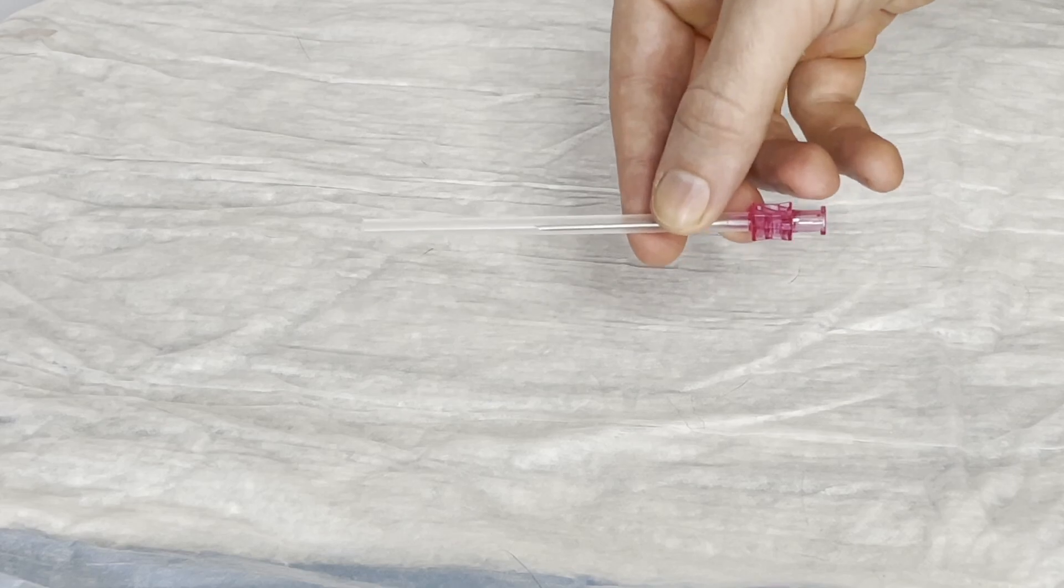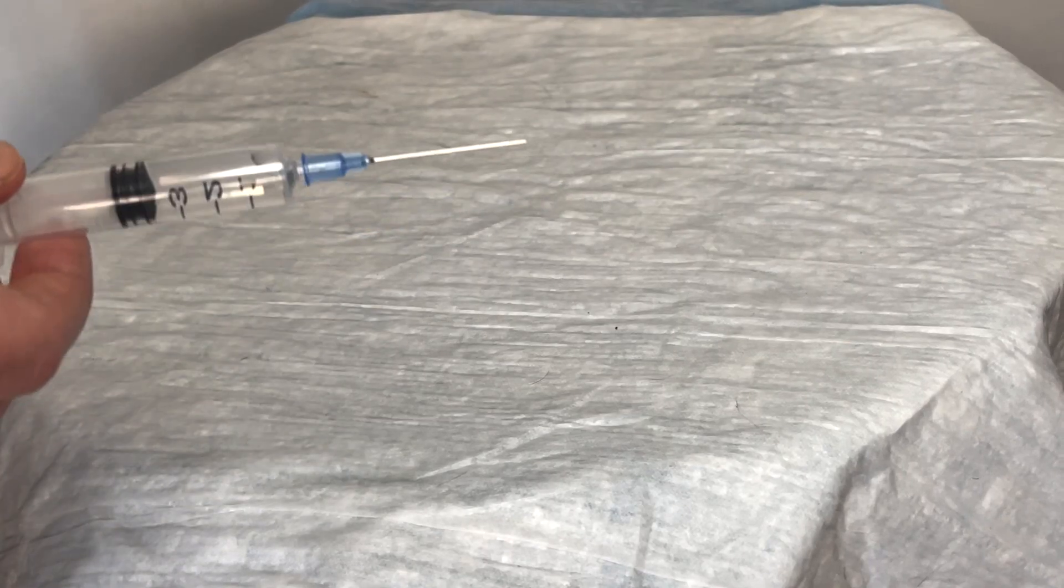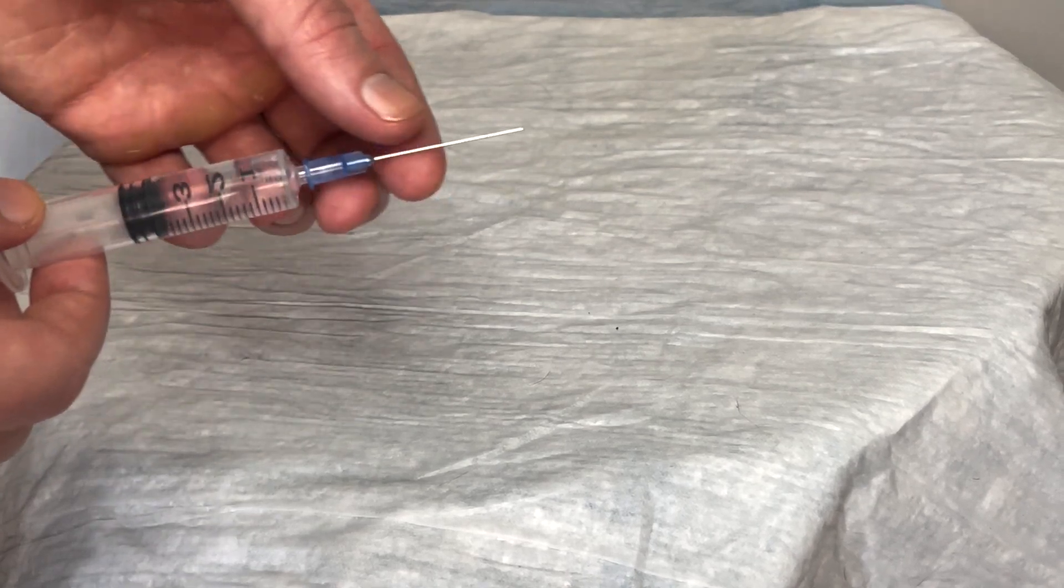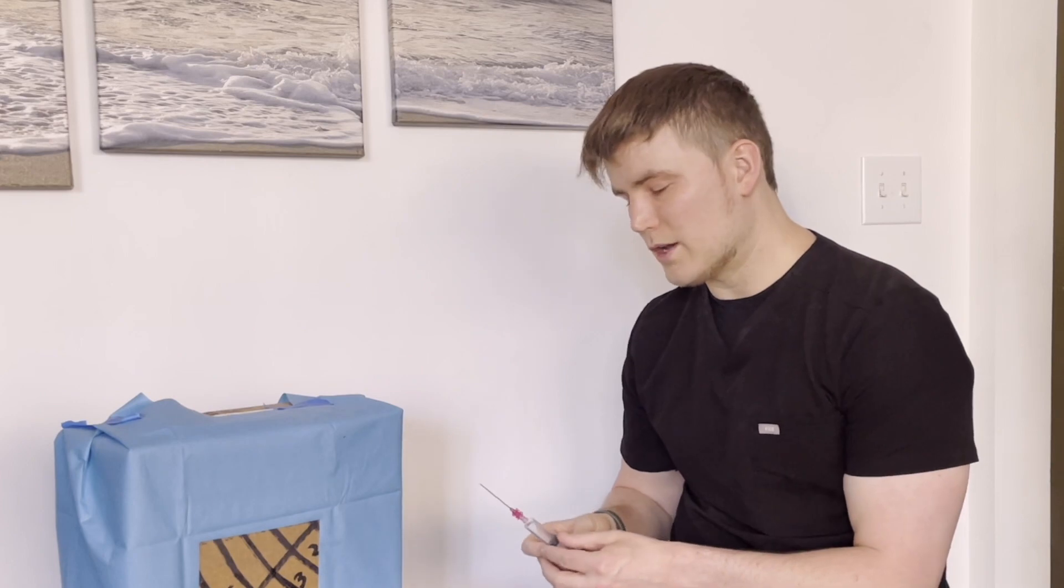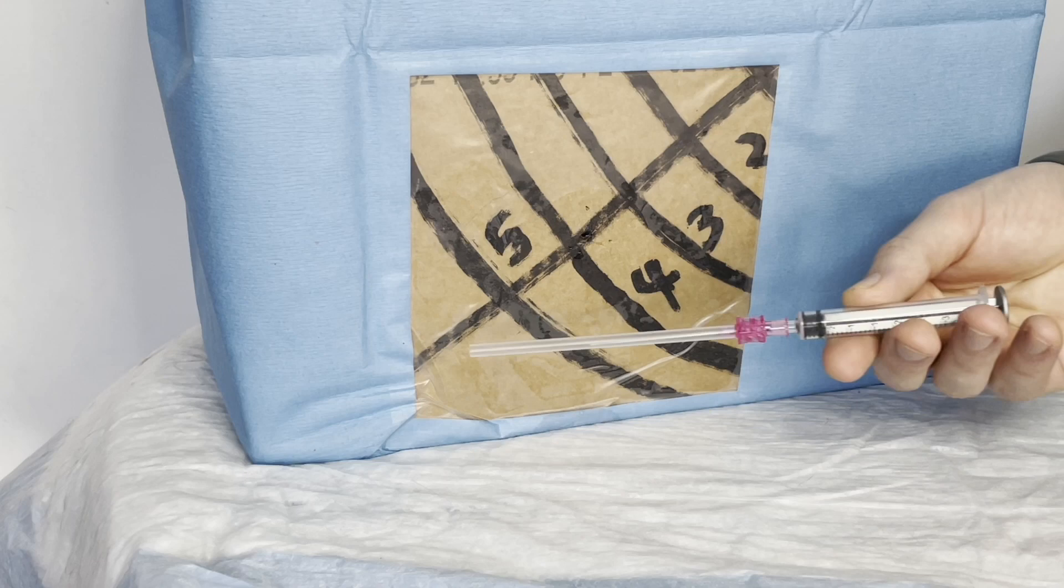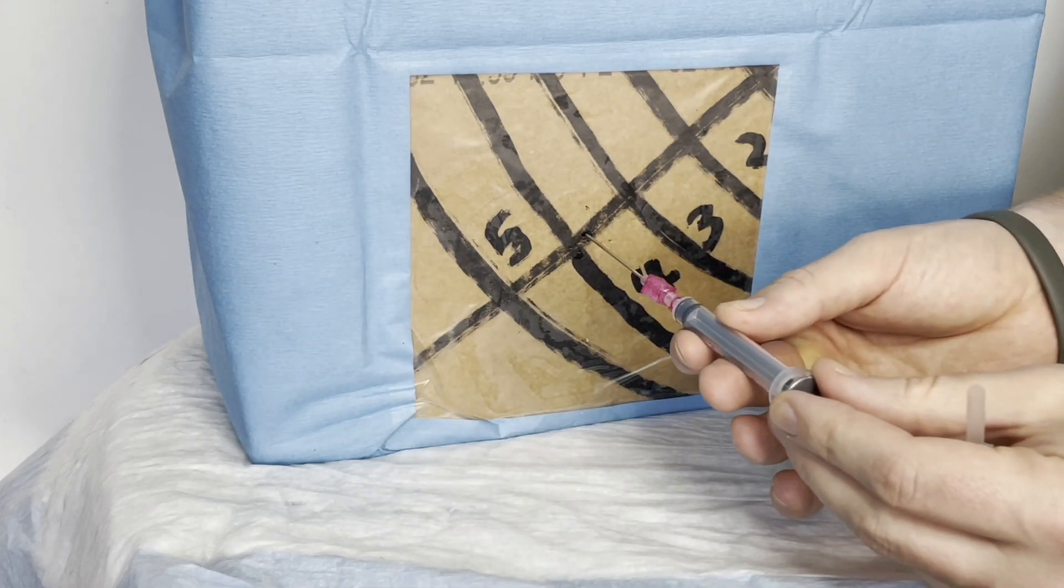Okay, so now I've got my introducer needle. This kit comes with two different sizes. This is the smaller size. This particular mock patient has a smaller body frame, so we don't need the very long needle. We're going to get to our pleural space just fine, and we know how far we have to go into the chest cavity to get to the pleural space based off of our lidocaine. So we've got our needle here. We know our estimated depth is going to be around this far.